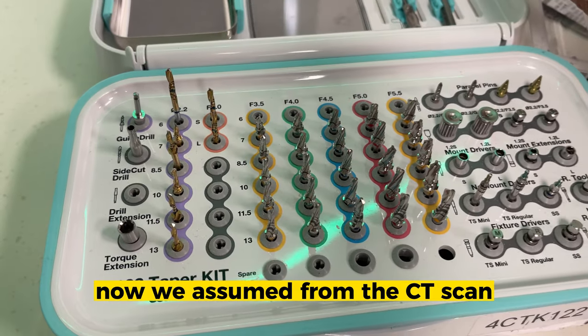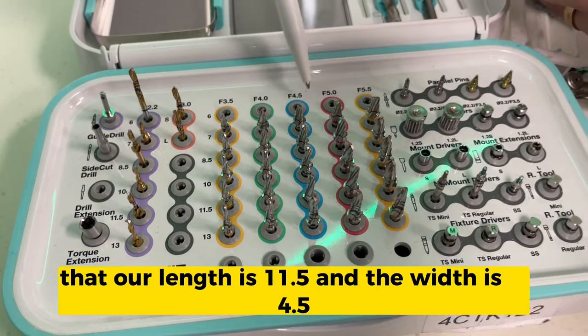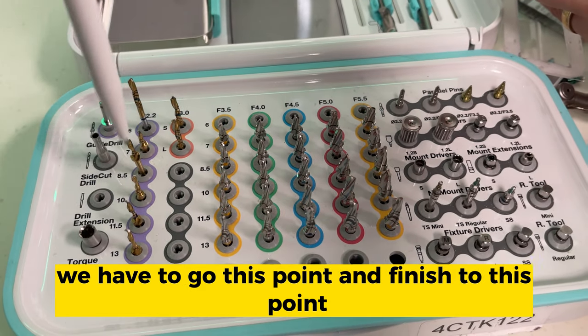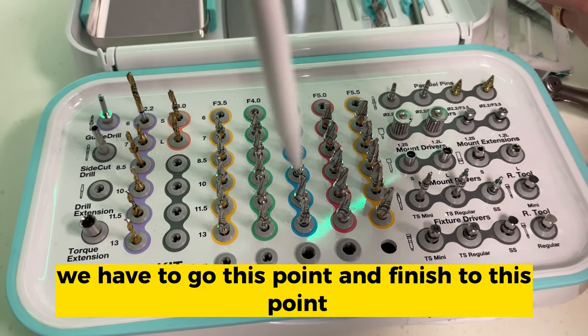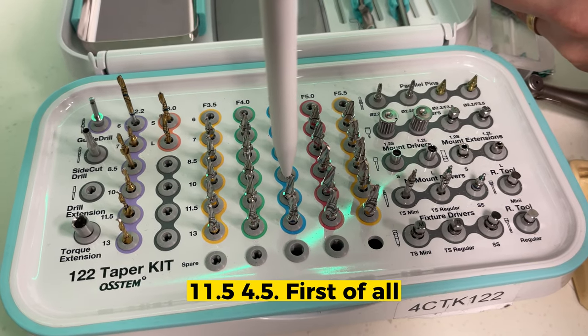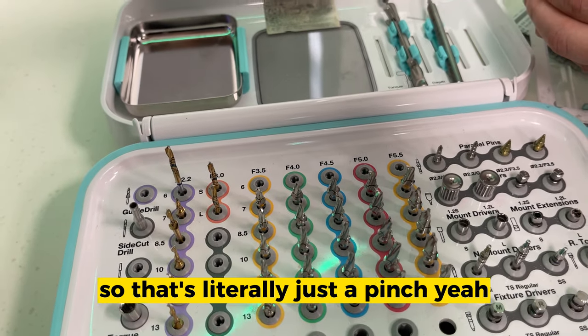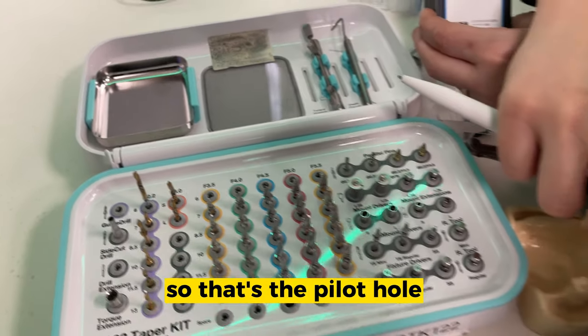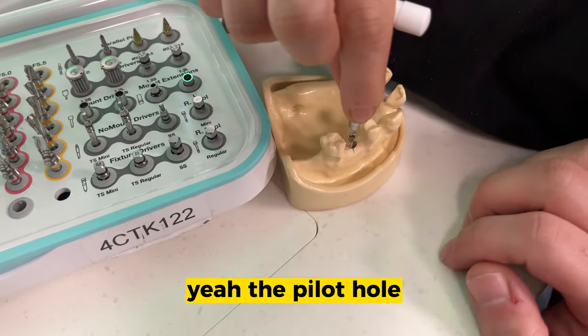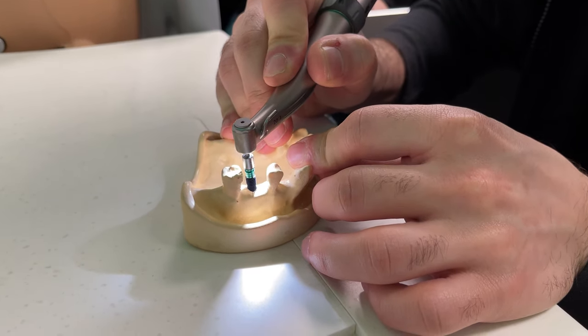Now, we assumed from the CT scans that our length is 11.5 and the width is 4.5. So literally, we have to go from this point and finish at this point. First of all, we have to start to make a hole. So that's literally just a pinch. Yeah, so that's the pilot hole.